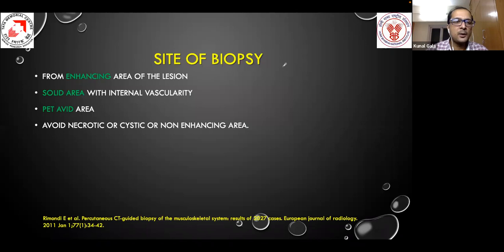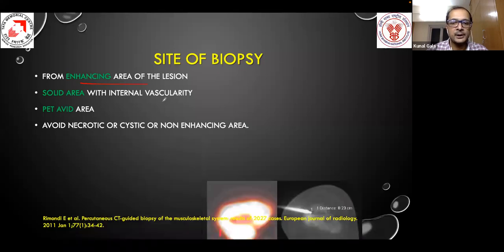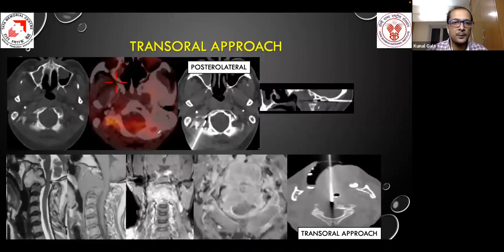For the site of biopsy, always choose a solid enhancing area, a PET avid area with internal vascularity, so as to avoid a negative biopsy. Avoid necrotic, cystic, non-enhancing areas for the biopsy.